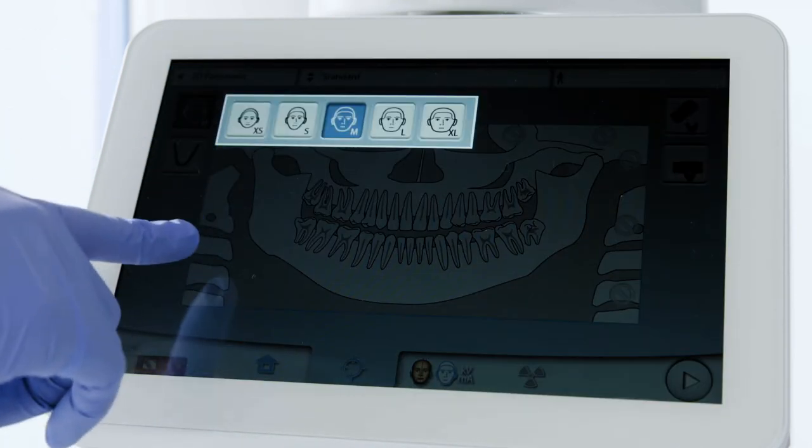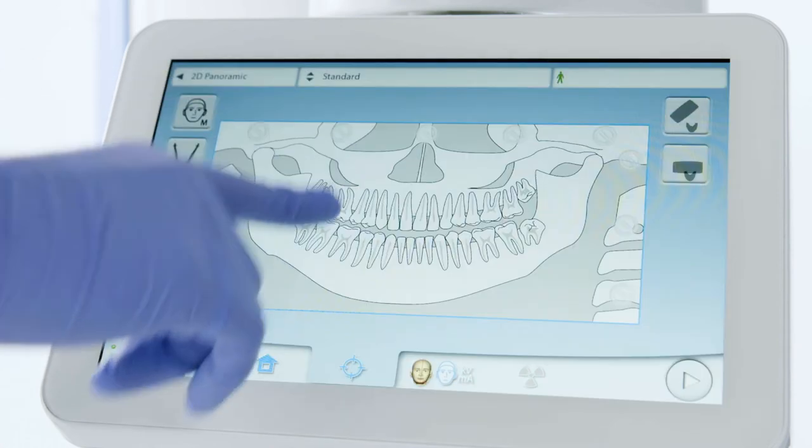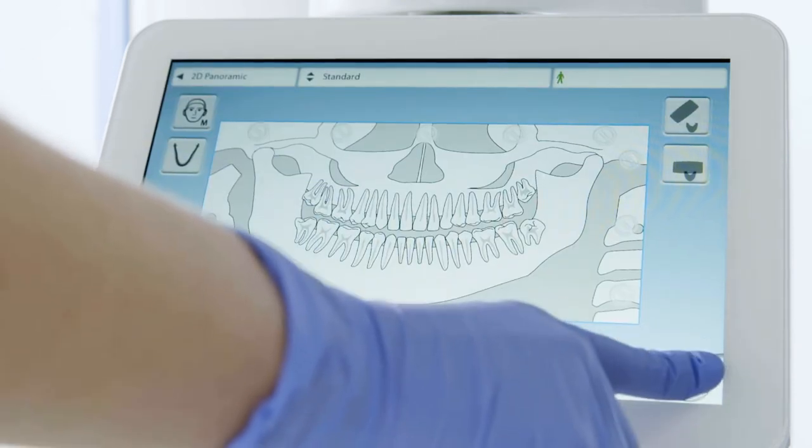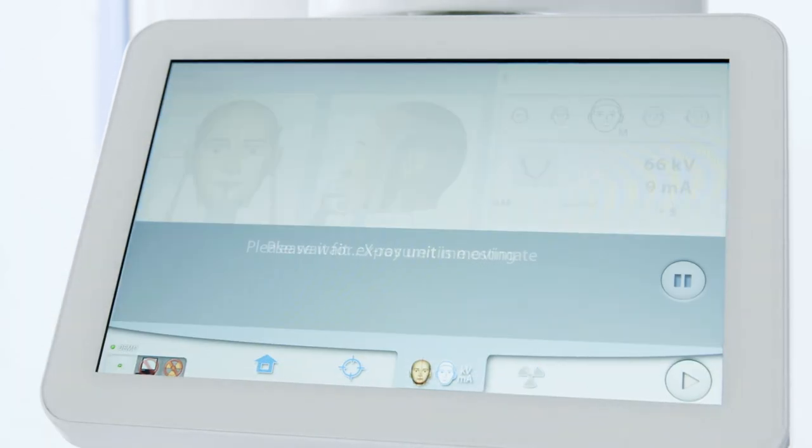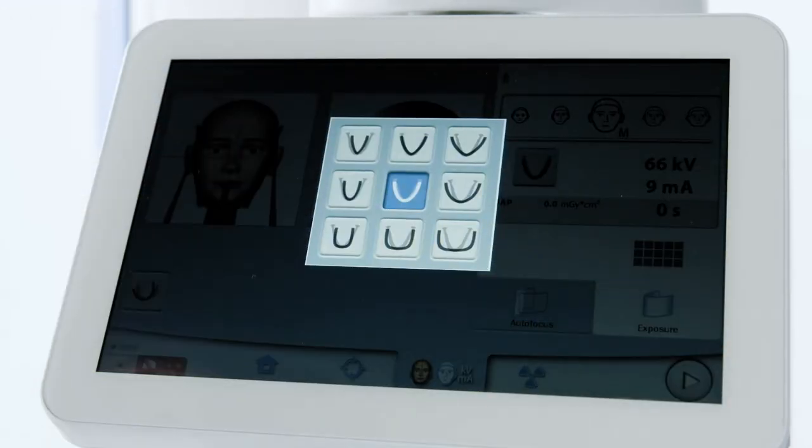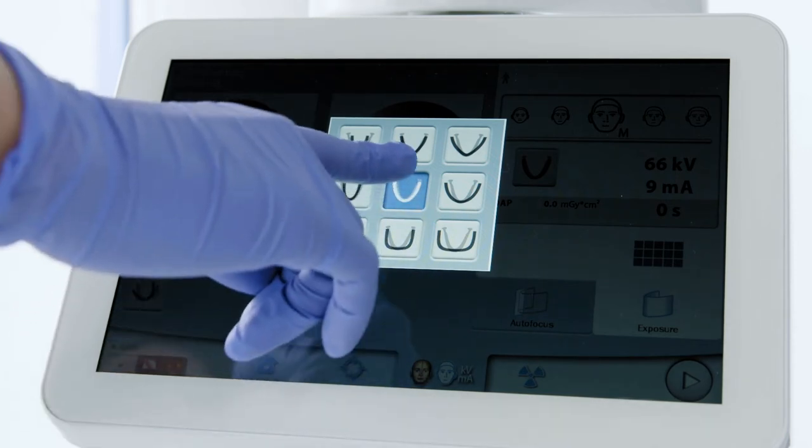If the patient size is questioned, it is better to choose the larger size. Press forward in the lower right of the touchpad to continue. Evaluate the patient's dentition and select the appropriate maxillary arch shape and size.